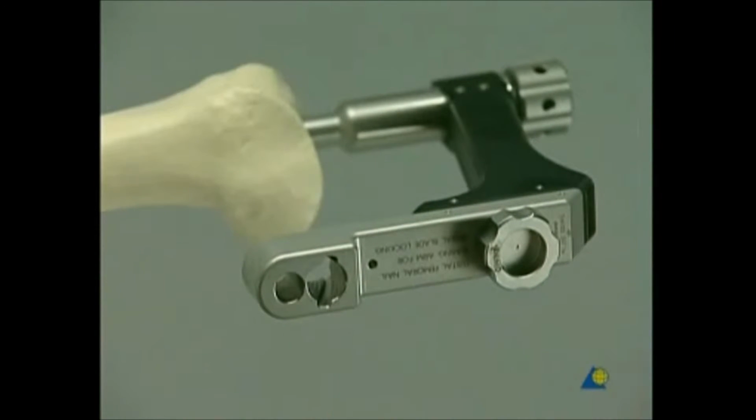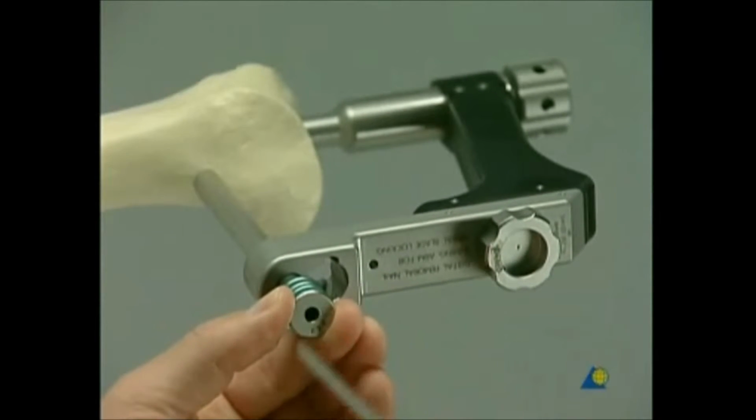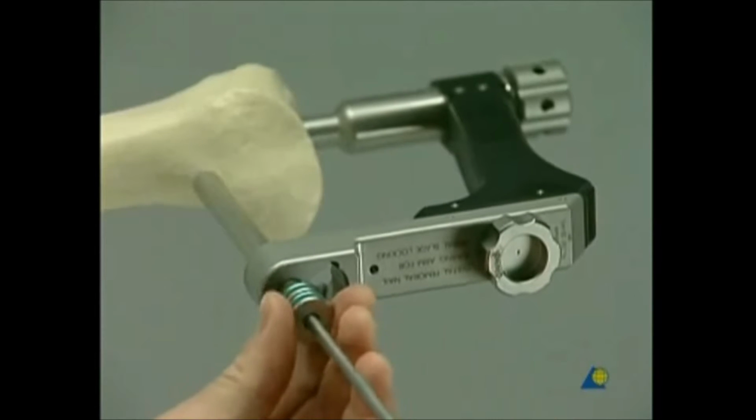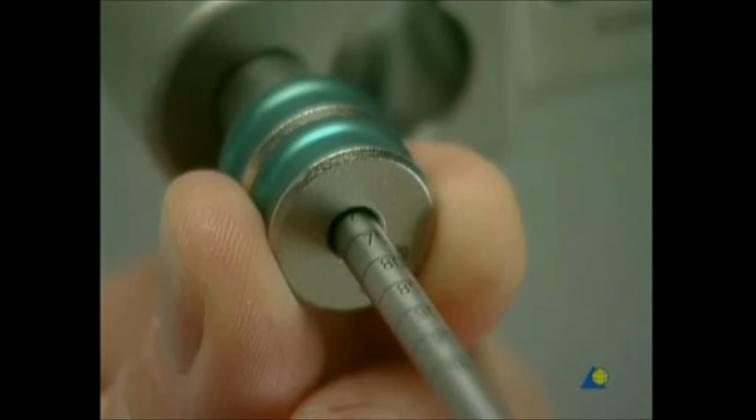The trocar assembly is inserted through the cranial hole on the aiming arm and advanced through a stab incision down to the bone. Then the trocar is removed. The screw canal is drilled with the calibrated drill bit. The length of the required screw can be read from the ring marks on the drill bit. The reading will only be correct if the drill sleeve is touching the bone.